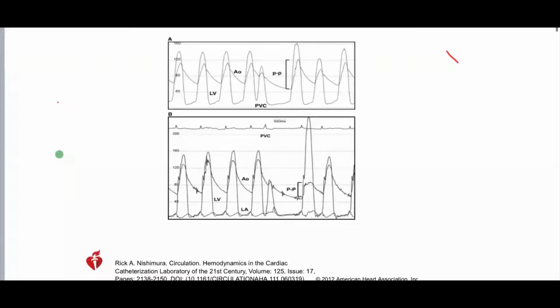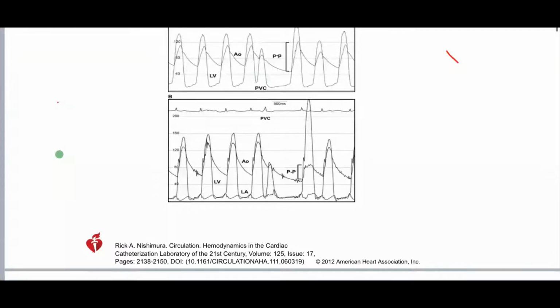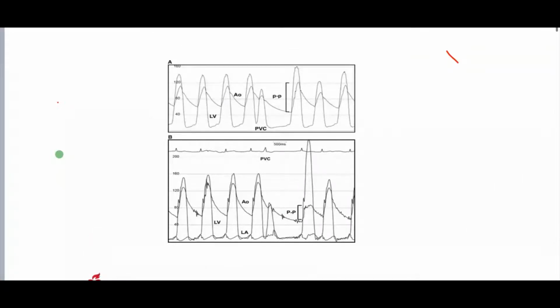Okay, what do we have here then? This is probably the most famous slide in cardiology, or the most famous invasive hemodynamics in cardiology. Brockenbrough phenomenon. Exactly. So can you explain it further? The changes of the volume before and after the PVC.